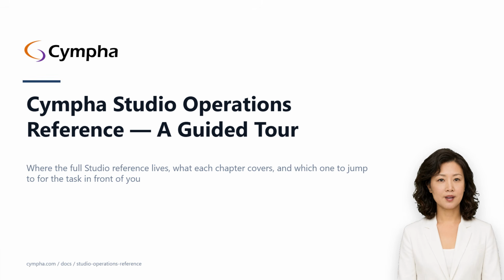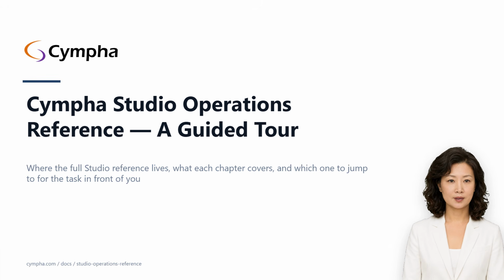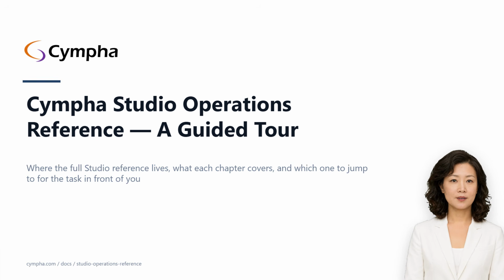This one is for everyone who uses Studio at studio.cympha.com: clinicians reviewing cases, designers cleaning meshes and staging tooth movements, lab managers verifying deliverables, anyone planning implants or tracing a CEF. Studio is a big product, and the how-to guides on cympha.com deliberately don't document every button and panel. That job belongs to 2 reference volumes hosted inside Studio.